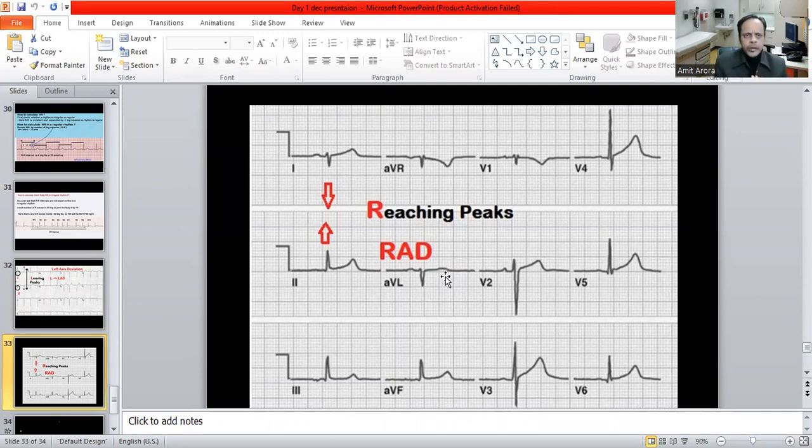I have created a video on calculating the axis in degrees. It is very long, and you need practice for this. I will upload it on the website. You can take an ECG paper, some graph paper, or a book from a bookstore, and practice on your own how to calculate the axis in degrees. Right now that is a very long topic to discuss. It is a long video, and you can go through it, understand and calculate on yourself.